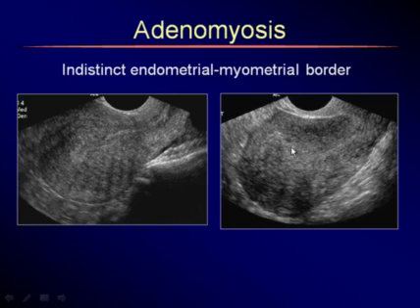Is this the endometrium? Should you measure it here? Should you measure it here? Where does it end exactly? So when you have that problem, you should think of the possibility of adenomyosis.